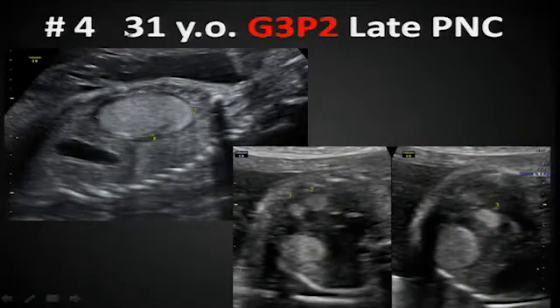All right, case number 4 is a 31-year-old, gravida 3, para 2, late prenatal care. Showed up at about 28 weeks. This is looking kind of like a sagittal oblique. We can see a little bit of the stomach, the diaphragm. This is in the mid-chest, back up into the neck. And then this is transverse of the chest.